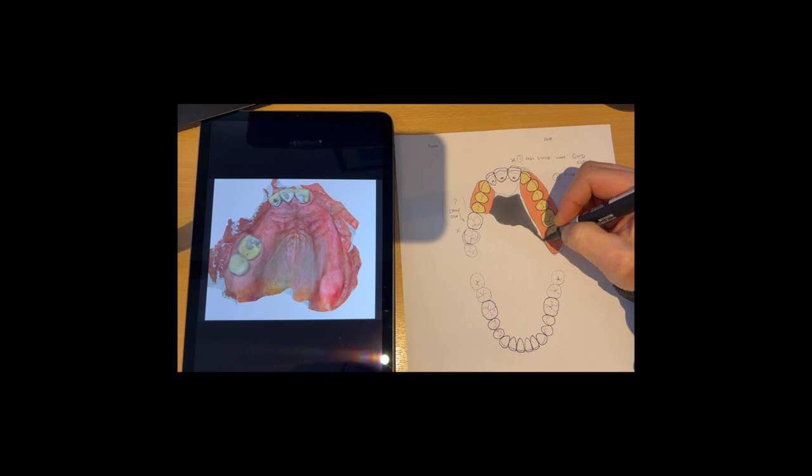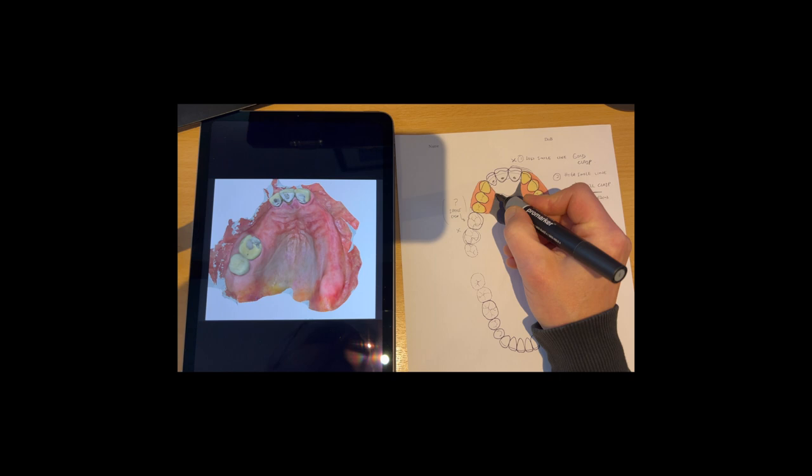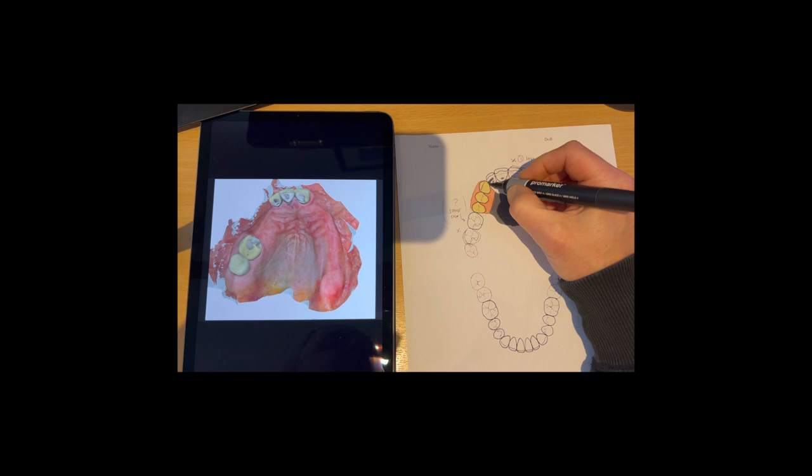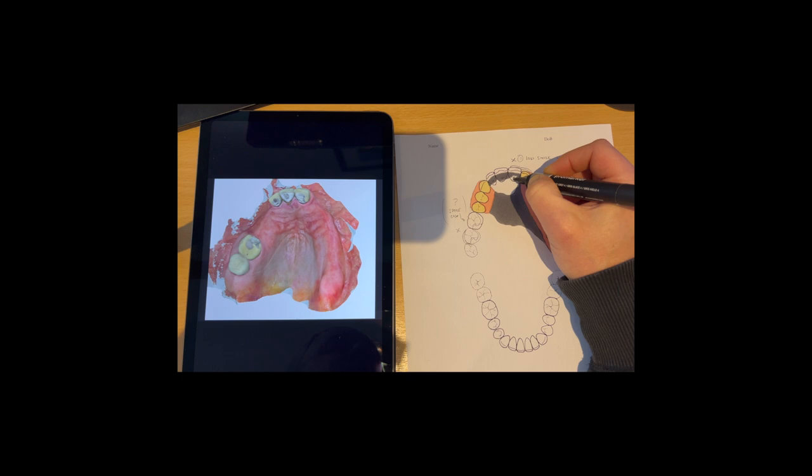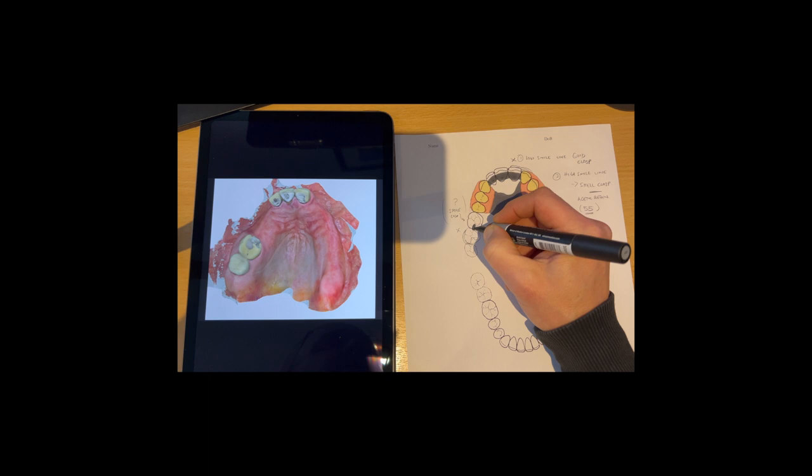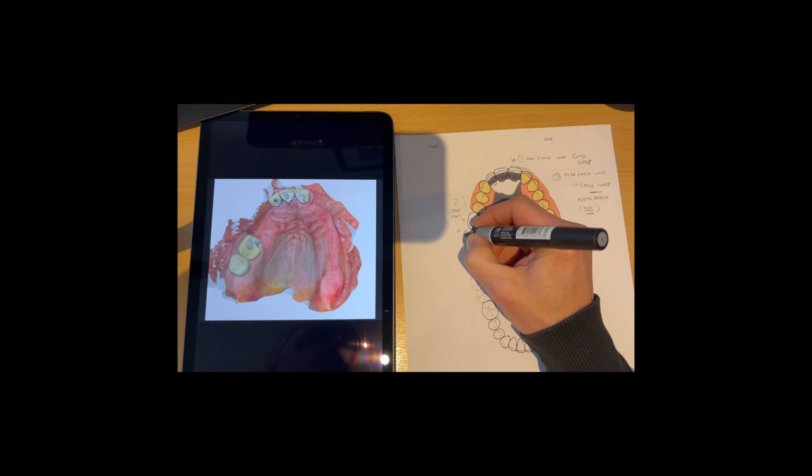These are metal backings. They help to support the denture and stay in place also. They will be areas where the lower teeth will bite onto these. Now these rests at the back here can be made bigger if need be for extra support, should that be the case.